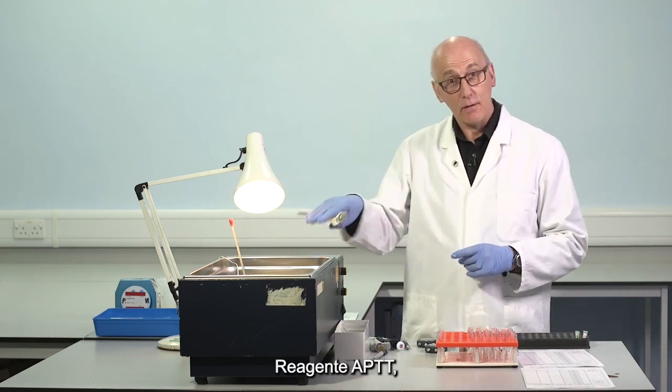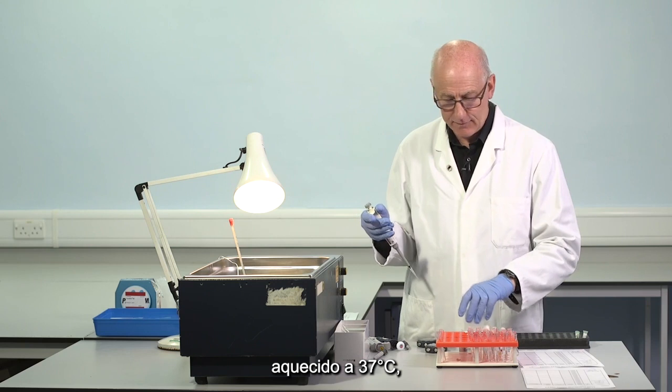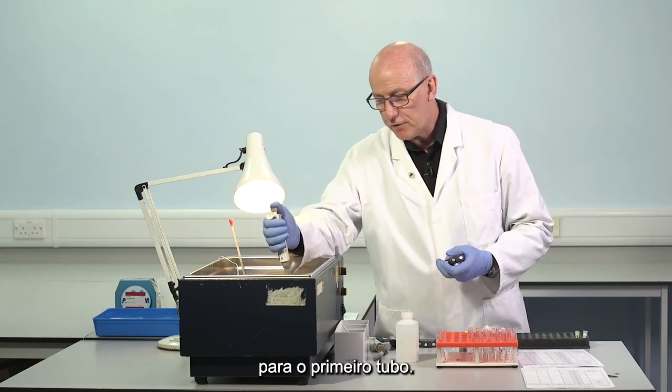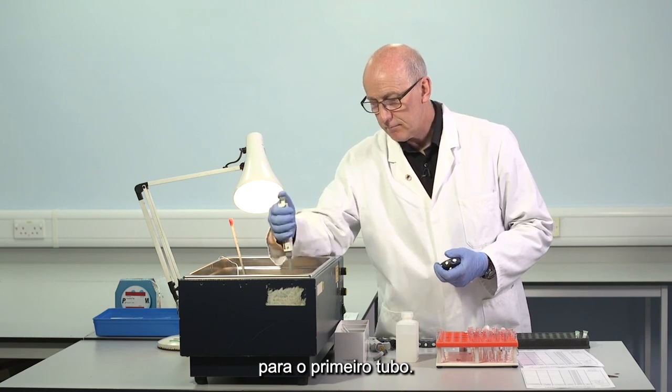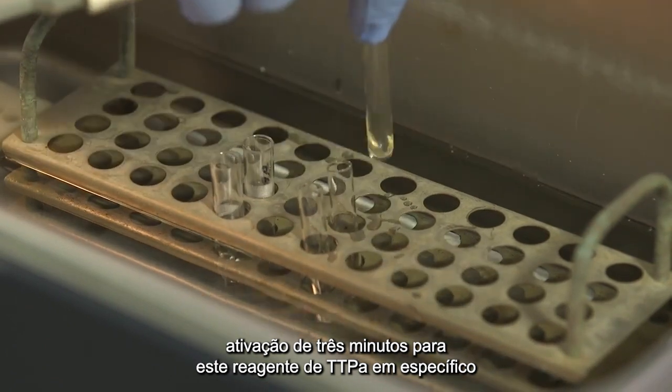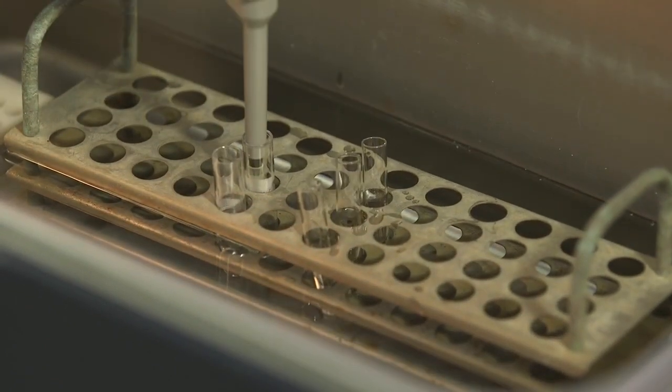APTT reagent, warmed to 37. To the first tube, start the watch, 3-minute activation for this particular APTT reagent.